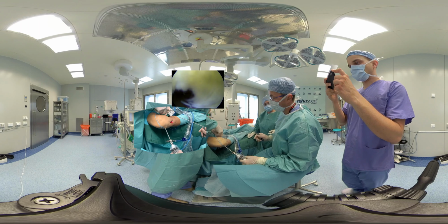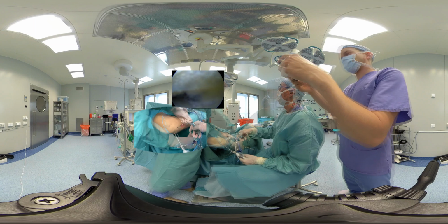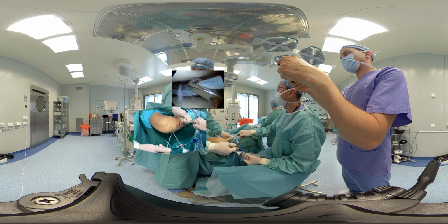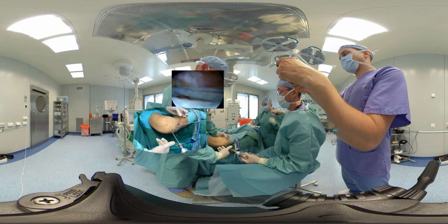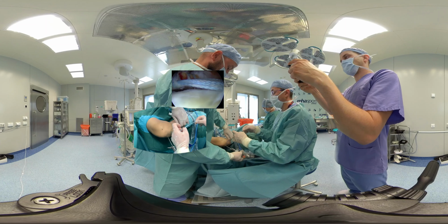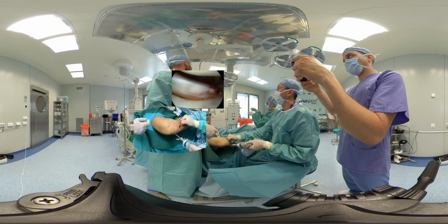We put all the tapes through the loops and pull them through the channel. Make sure that the tapes are in the same channel with the guide threads and are not separated by any soft tissue bridges. If you are sure that they pass through the tunnel, we drag them and tighten the meniscus root.